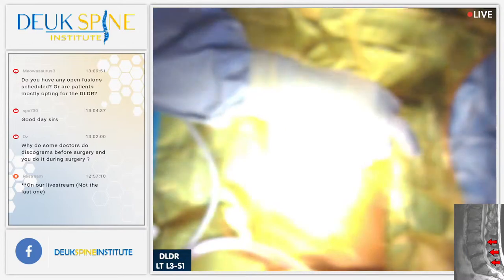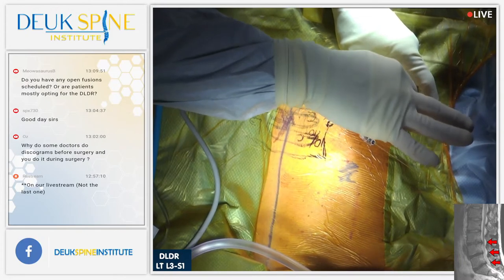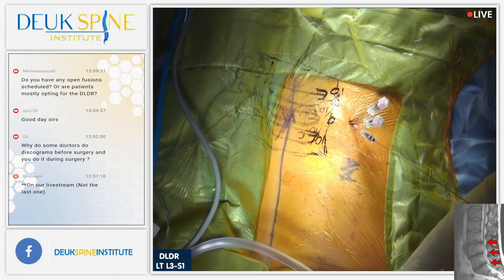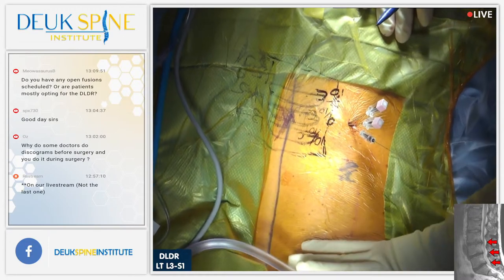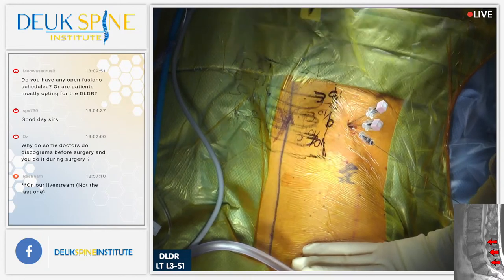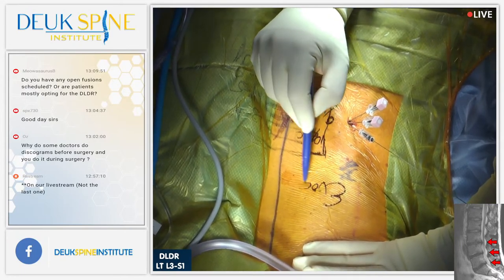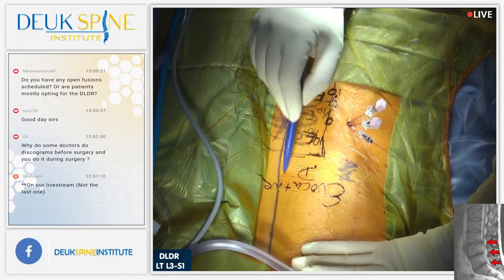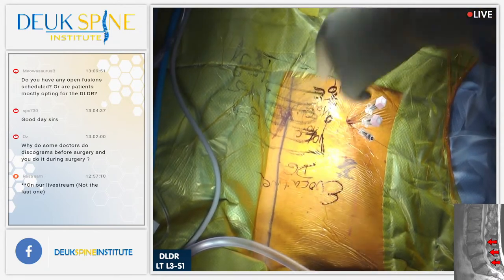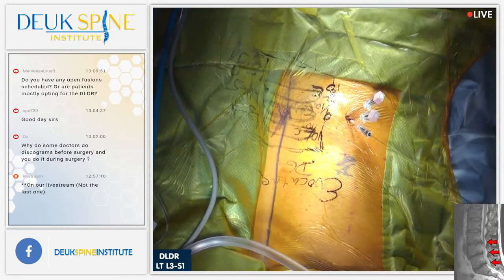So this is absolutely incredible, wonderful news for him. We found the causes of his back pain. It's three discs in his back. That's just medicine going in your arm. Don't worry about it. That's going to put you to sleep. Count out loud for me, 1 to 100. Keep going. So basically, I tested these three discs with a discogram called an evocative discogram, which we do on every one of these lumbar and thoracic cases. And indeed, it produced pain at all three discs. The worst one was the top one. Surprising, because if you look at the MRI, the top one is like the newest.